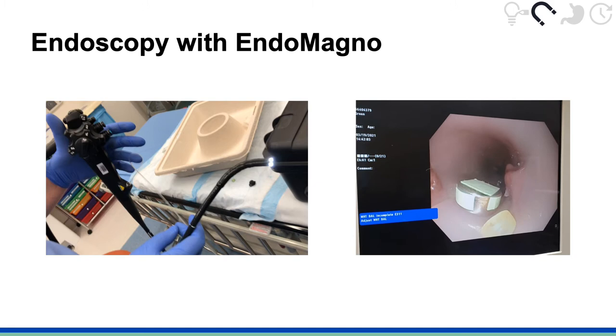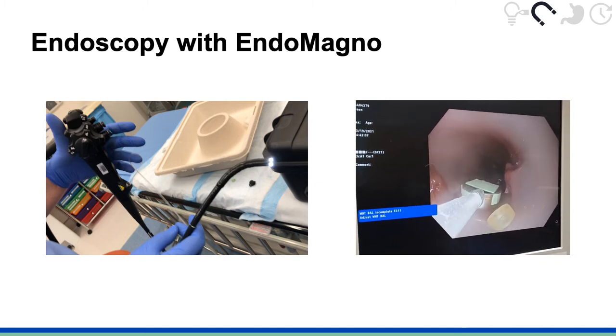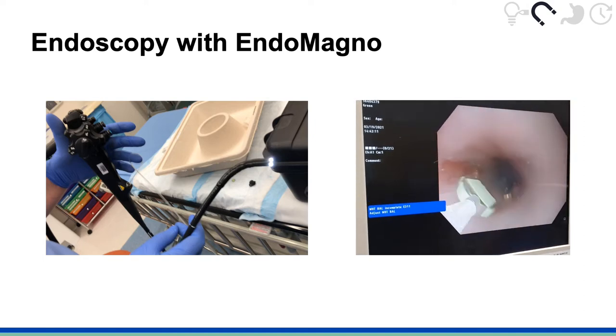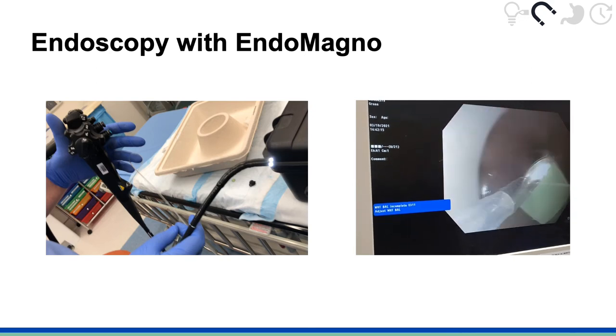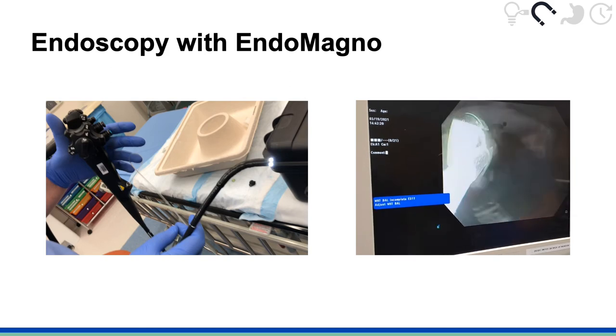The tip of the endoscope with the instrument channel also has a camera that feeds into an external monitor. The tip of the Endomagno is extended to attract the button battery. The endoscope is then pulled back out through the upper GI tract and Endomagno successfully holds onto the button battery, allowing for extraction of the object.